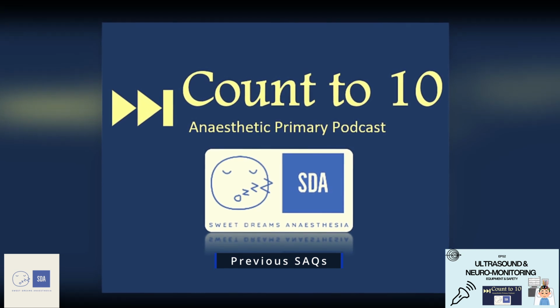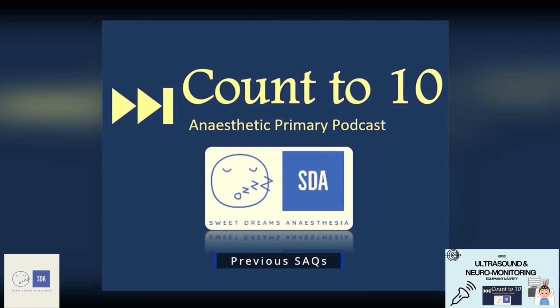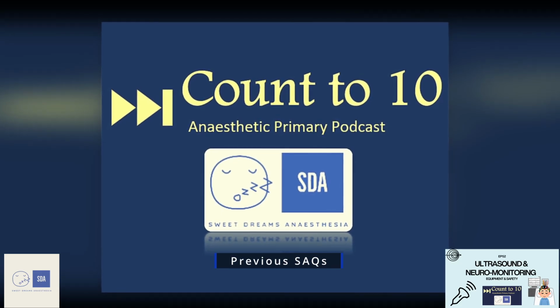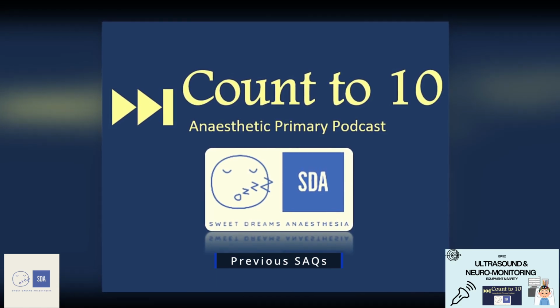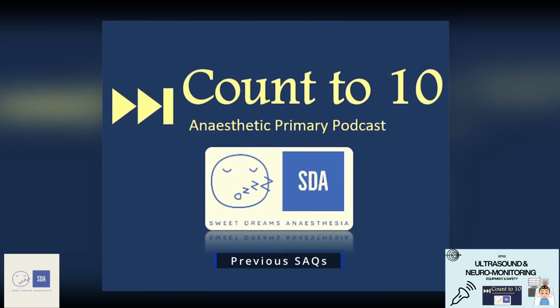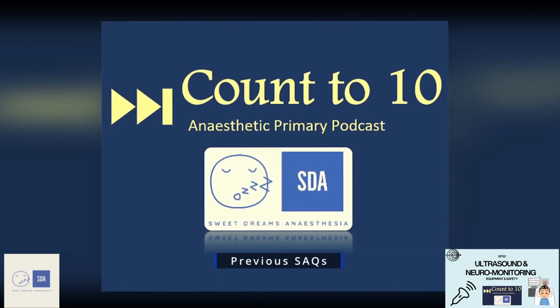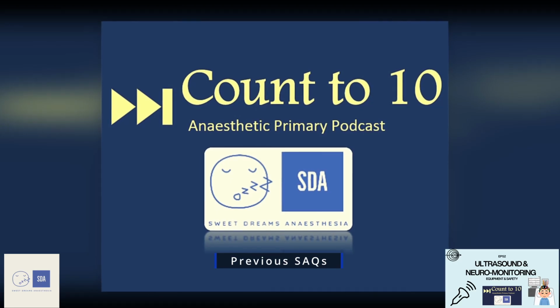Then with the other transducer properties, I would simply speak about that the probe within it has a backing material, the piezoelectric crystals, an acoustic matching layer, and an acoustic lens. If you had time, you can add in the main aim of these features is just to ensure that the beam of ultrasound is focused towards its target and it prevents attenuation of that sound wave.